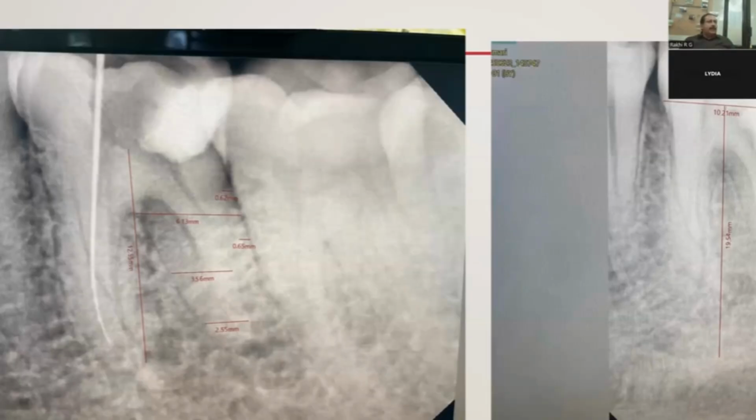For a metal ceramic crown, you would definitely require 1 millimeter of space for metal and another millimeter for ceramic. To make it full metal, you would require still less area between the two teeth. I'll repeat it: a space of 2 millimeters is required for a metal ceramic crown. If you make it fully metal, then slightly less is required. So leave more space between the tooth and the implant site, or the implant and the nearby tooth which you're going to connect. Which area will you have?